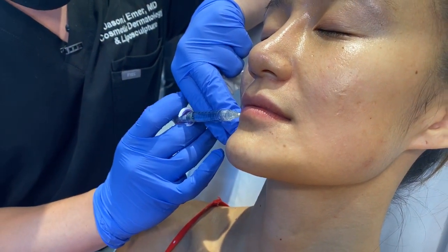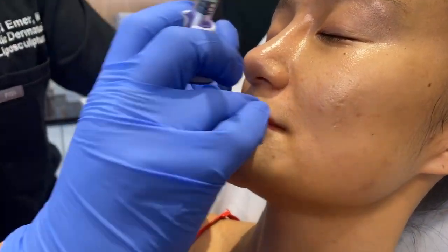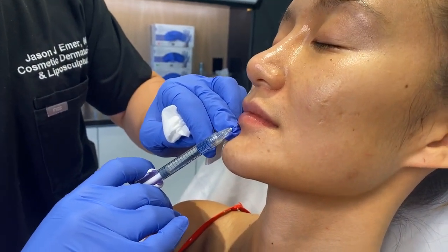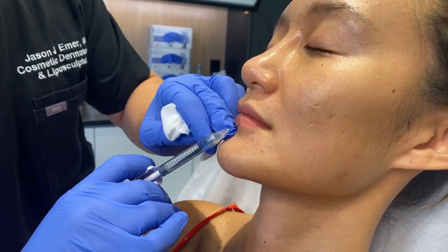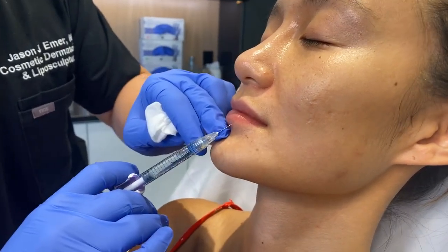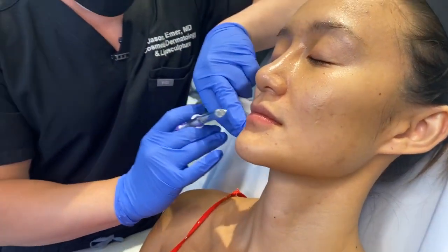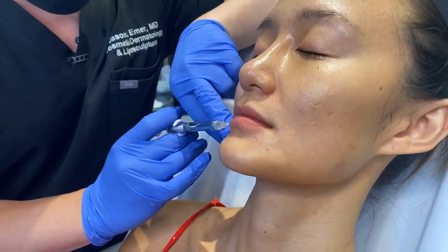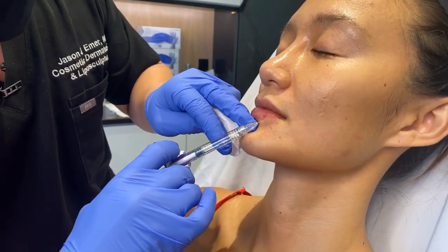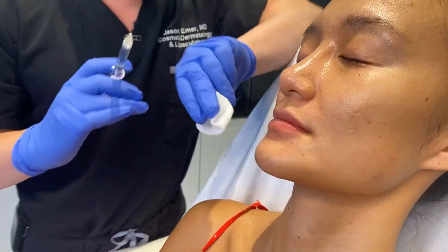But if you do these really small aliquots, little baby threads. Now, there's a huge trend right now for people to do this keyhole pout, or what some people call the cleavage technique, where they put a little toothpick or floss in the middle of the lip and make a line there. I would only do that in somebody who has a lip with that shape. I think it makes it look overdone. So we're trying to keep it where nobody knows she had anything done. We're doing little pillars to just get the center part to look a little more cute. And that's it, nothing crazy.